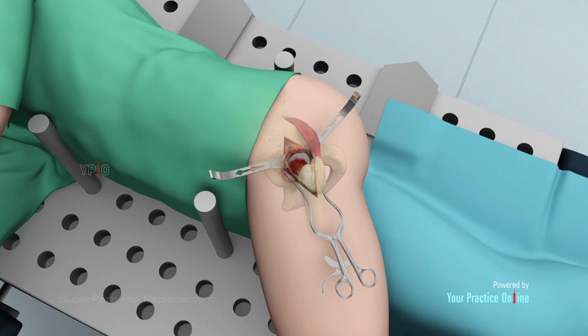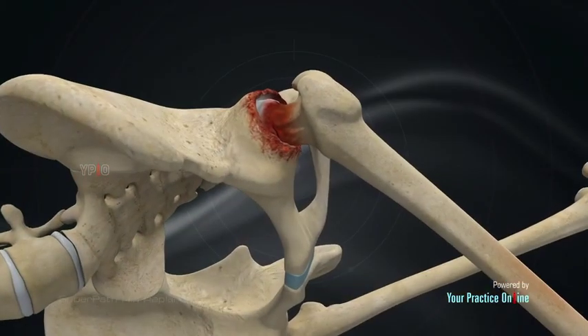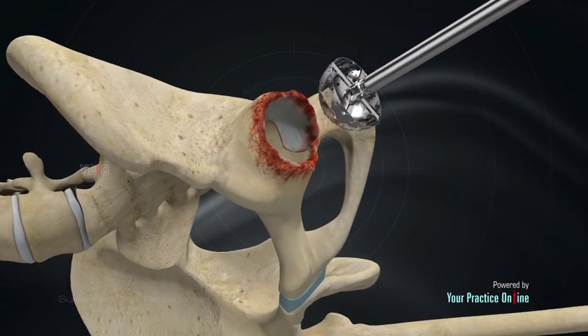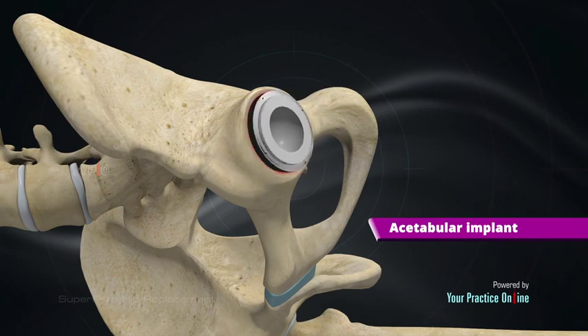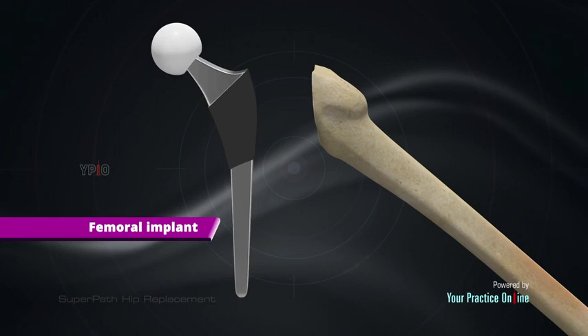The femur is prepared to receive the femoral implant, and the damaged femoral head is cut and removed. The acetabular socket is cleaned out, removing any damaged cartilage. A dome-shaped acetabular implant is placed into the socket.